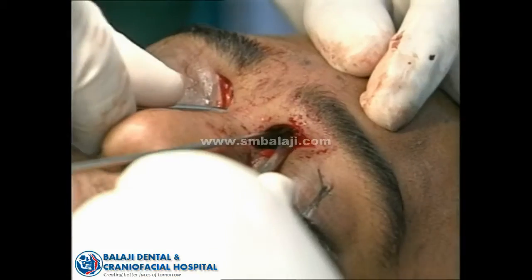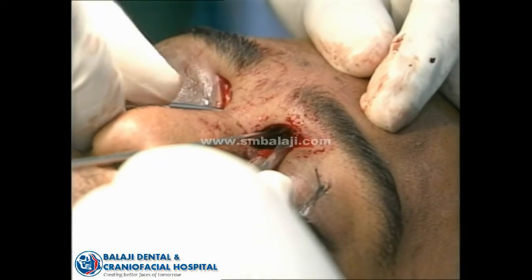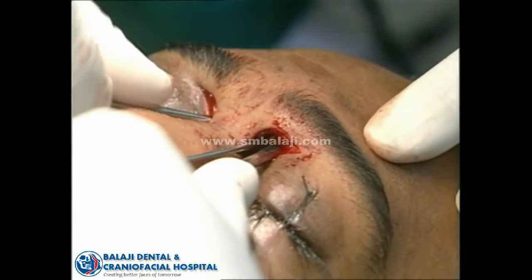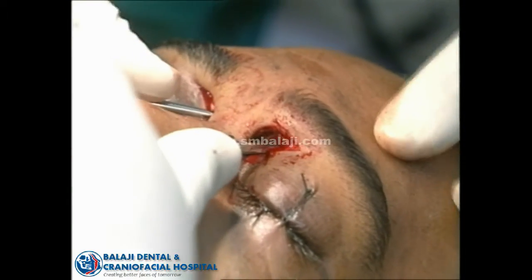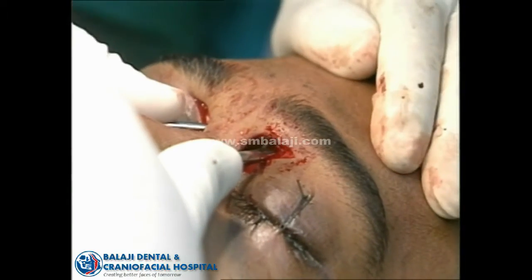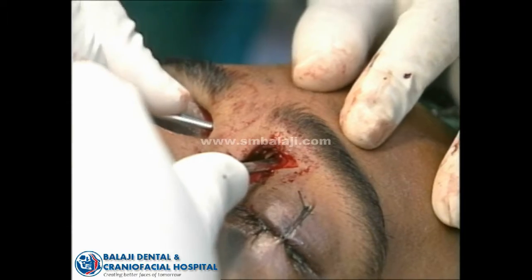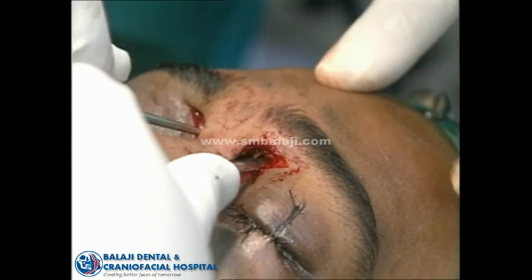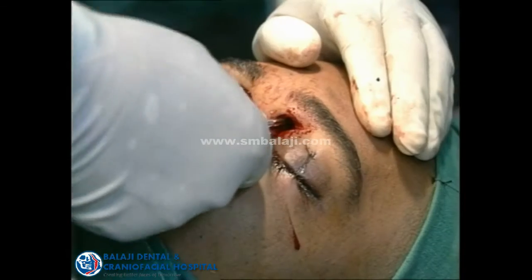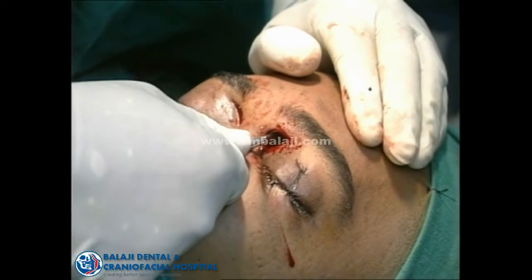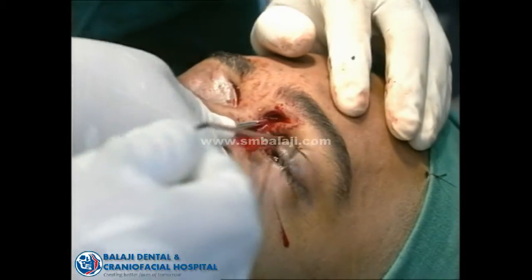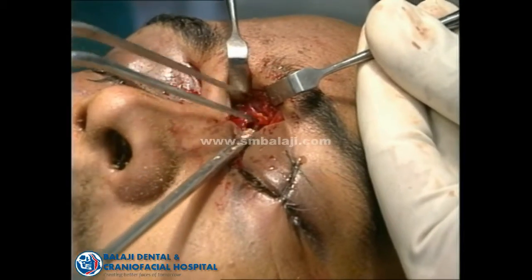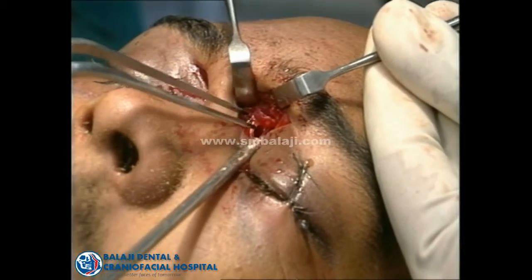I am using a periosteal elevator and you can see me elevating the fracture. You can see carefully the bone — I have elevated it nicely. The outer table is nicely elevated. The scar is also minimal, and I can see blood and CSF coming out.